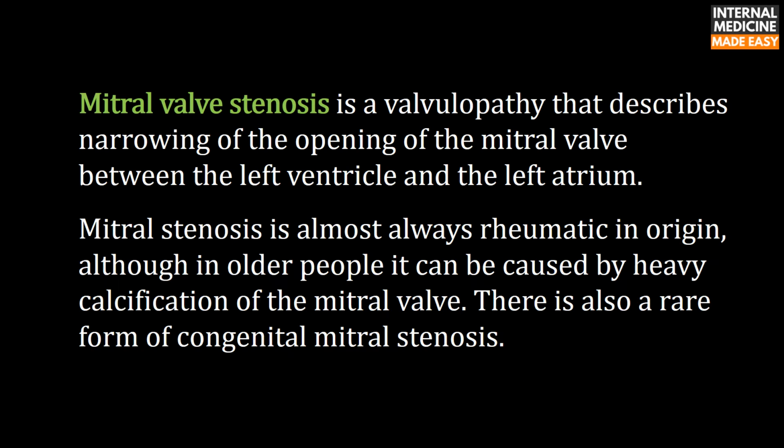Mitral valve stenosis is a valvulopathy that describes narrowing of the opening of the mitral valve between the left ventricle and the left atrium. Mitral stenosis is almost always rheumatic in origin, although in older people it can be caused by heavy calcification of the mitral valve. There is also a rare form of congenital mitral stenosis.